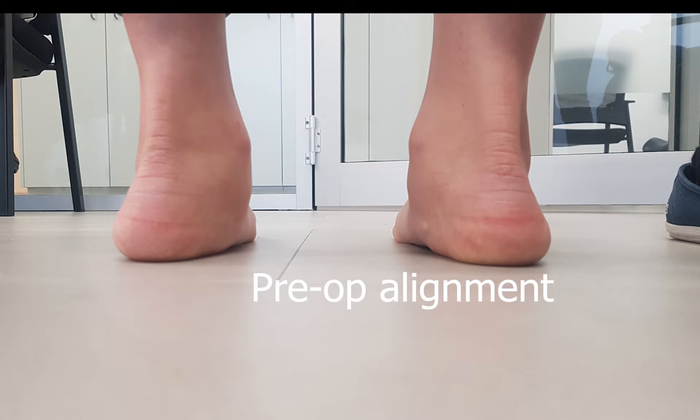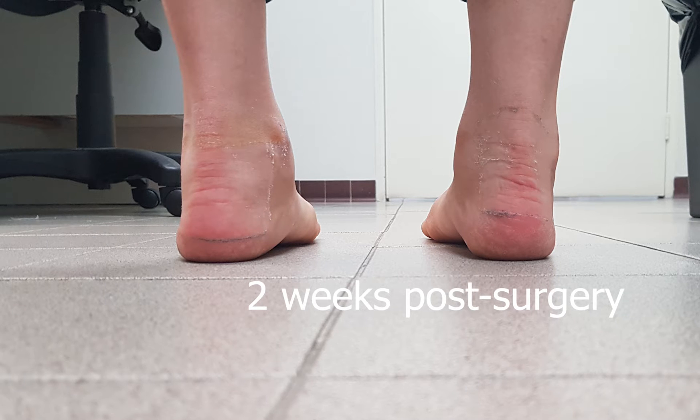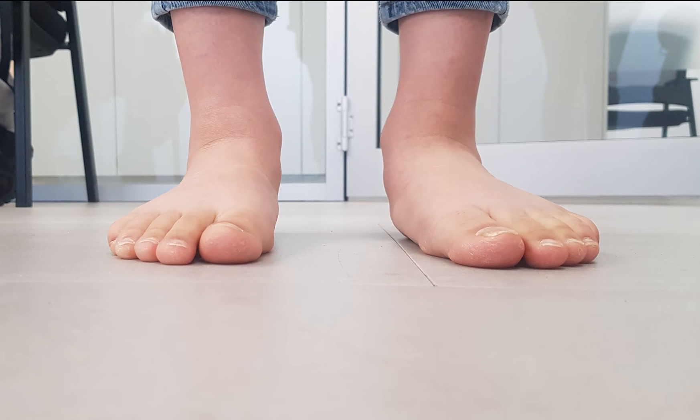With a maximally pronated subtalar joint, when the subtalar joint is brought back to neutral, it's quite common to see the development of a forefoot supinatus. Post-surgery we see this with the subtalar joint arthroresis, and it can be over-exaggerated when there is over-exertion of the tibialis anterior tendon. It contributes to elevation of the first ray and the development of forefoot supinatus. Along with elevation of the first ray, sometimes you can also see some in-toeing that occurs with it. The amount of in-toeing present is important because it can exaggerate the amount of subtalar joint supination actually occurring.